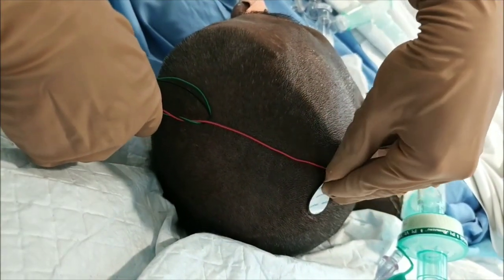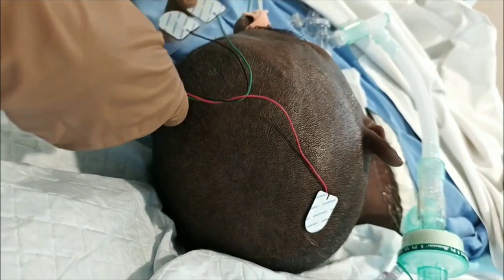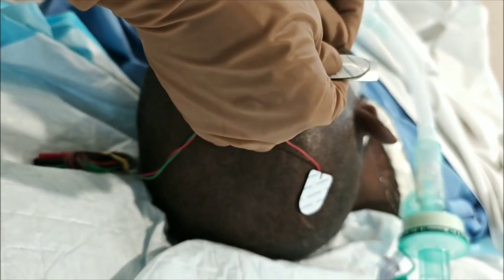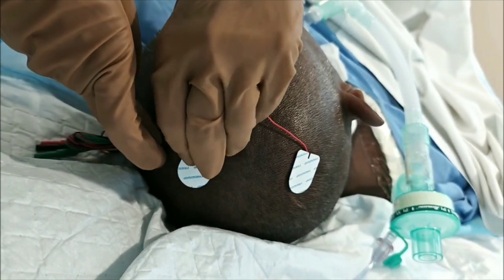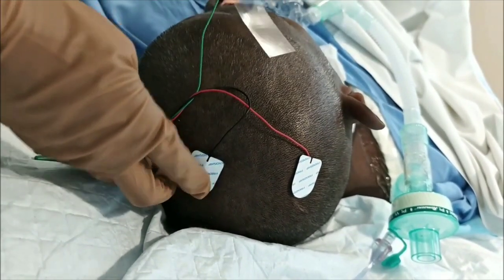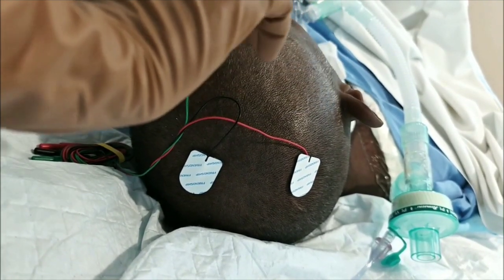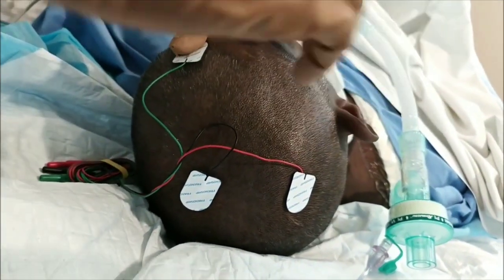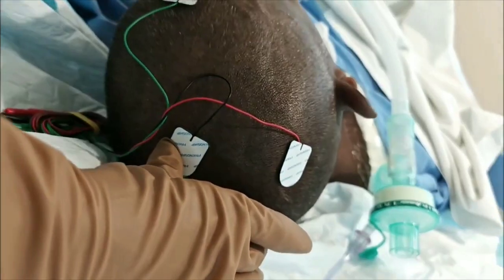The active electrode will be placed exactly on C3-prime, around here. The reference should be placed on CZ-prime, a little posteriorly around here. The ground can be placed between them — here I'm placing it on the forehead area. So this is your active, this is the recording electrode, and this is the ground.